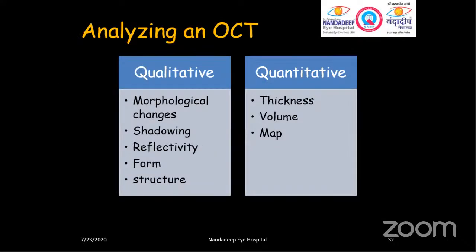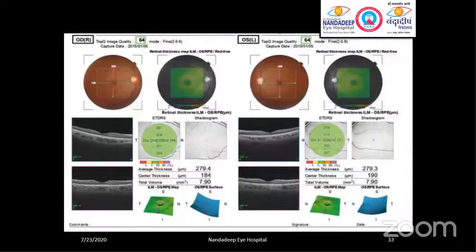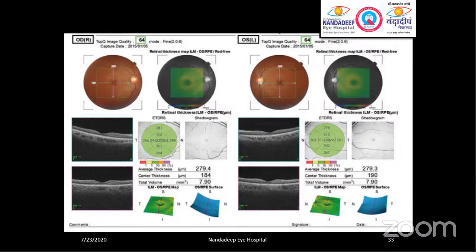This is a very important point: an OCT report can be analyzed both qualitatively and quantitatively. In this particular report, we can see the scan quality, detect whether there is shadowing or reflectivity, and assess the thickness and volume of the entire scan profile. We can see the measurements here. Through this, we can measure what is the subfoveal thickness and what is the foveal thickness. OCT provides a very good role in analyzing the report both qualitatively and quantitatively.